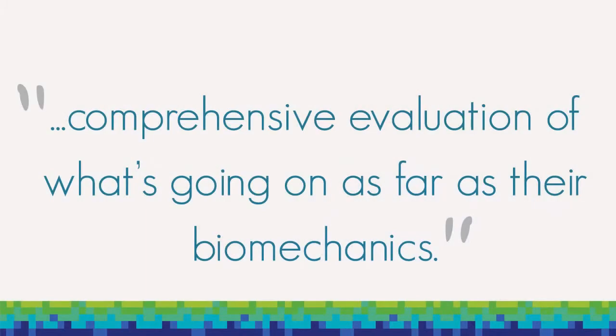evaluate with the F-scan. I just go ahead and record what I'm seeing. Then we have the patient back off, shut the treadmill down. I'll evaluate the data real quick, make sure everything looks good.